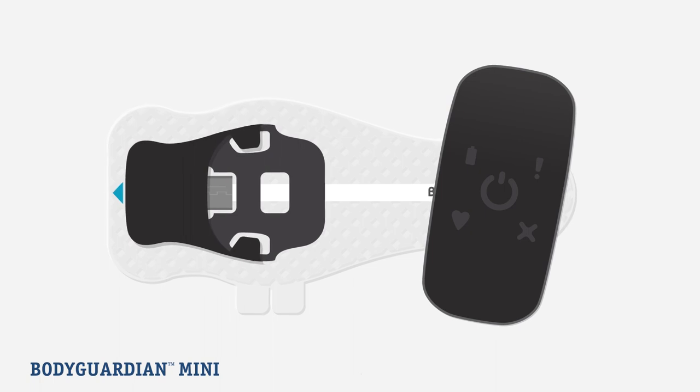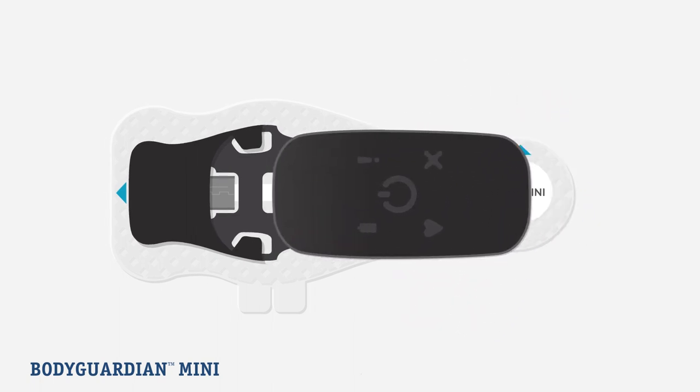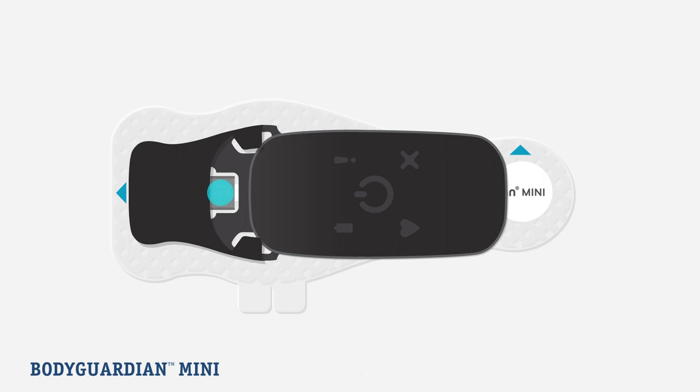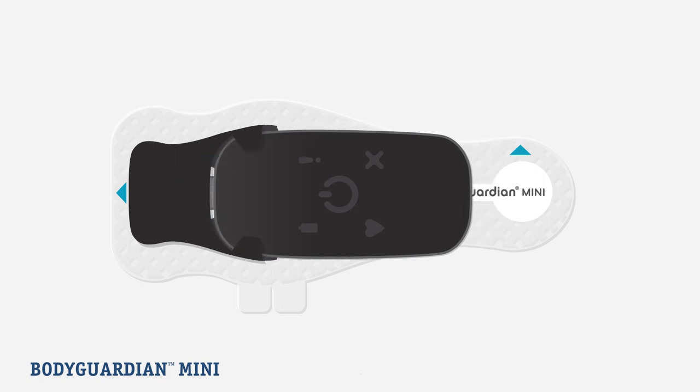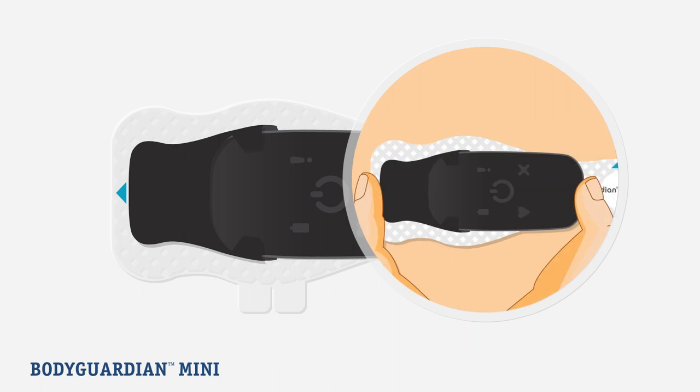Now that you have decided on a monitor placement and prepared your skin, let's attach the monitor. Slide the monitor onto the black molding on the strip until the micro USB connector on the strip is inserted completely into the monitor. This is most easily accomplished on a flat surface like a table. To line up the micro USB connector with the port on the monitor, you may need to wiggle the monitor slightly to align. To ensure a good connection, pinch together with thumb and index finger.